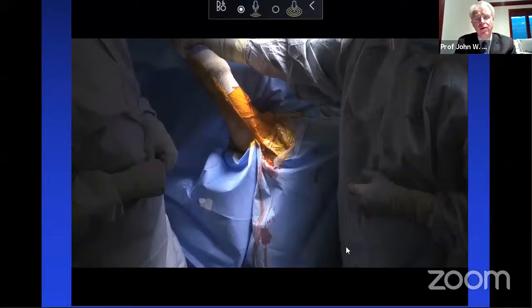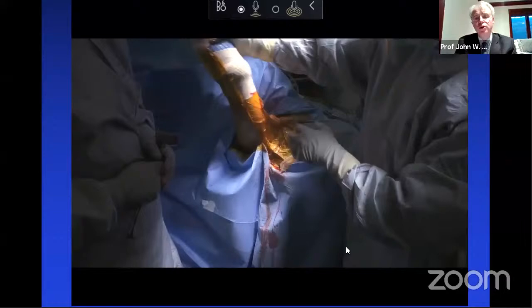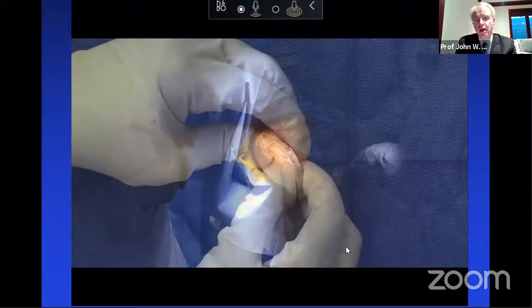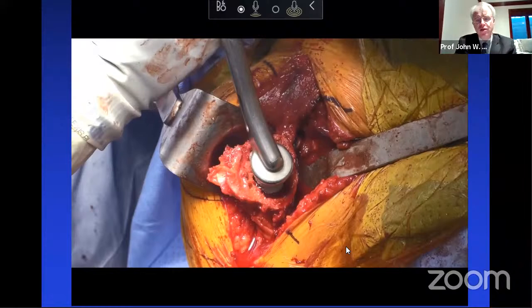And then the one I most commonly use now is this +6 offset tray. And what you'll see is better overhead elevation, looser joints, so we're not putting these in too tight. I think this is really helpful, particularly in smaller patients, and it avoids you overstuffing the shoulder, which we really need to avoid. So we'll be able to go ahead and snap that together. I use a little short stem, as you can see there. A number of us have gone to using E1 poly on reverses because we think that wear is going to be the limiting factor in reverse arthroplasty in many of these patients.